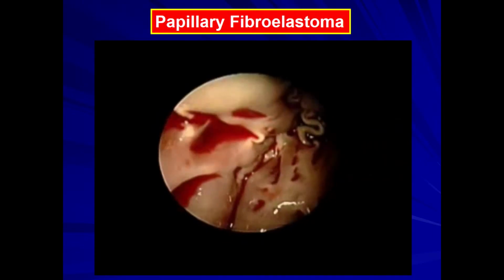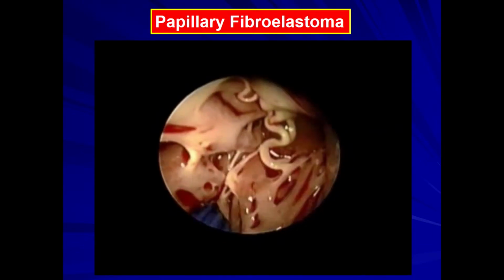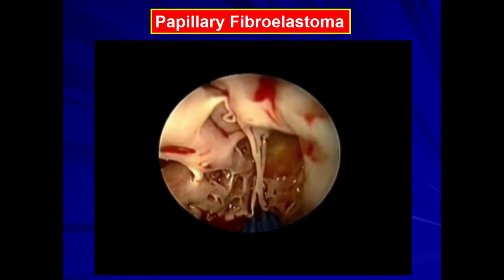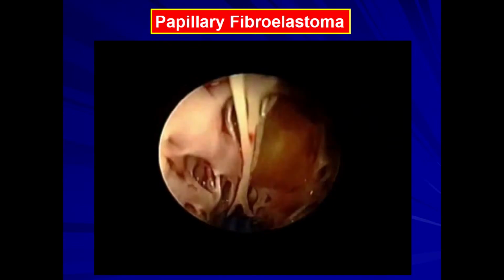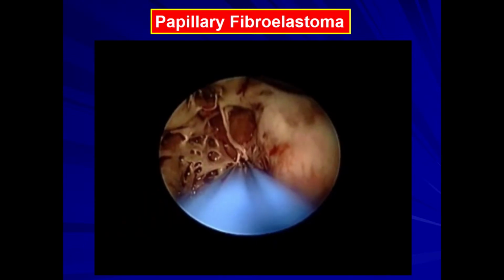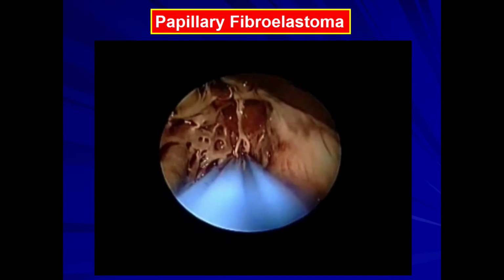You see all the trabeculation there, and you're going to see the mass in just a few more seconds. You can see it's hiding there behind that trabeculae. It's a very mucoid, yellow-looking sort of mass, and it looks like it's very tightly adherent and hidden behind all the trabeculations in the apex.